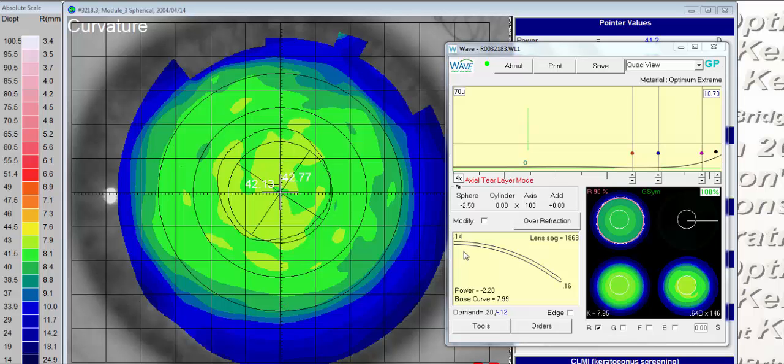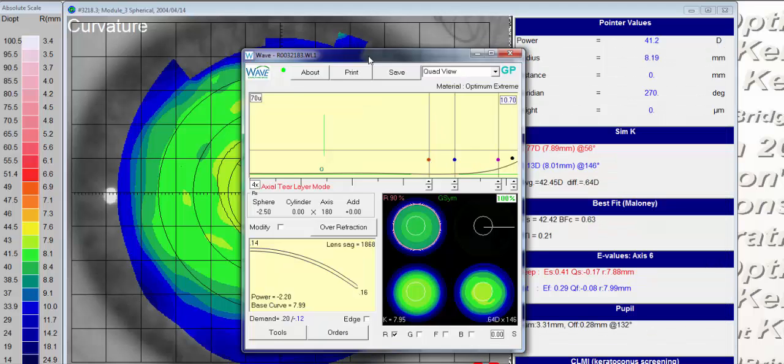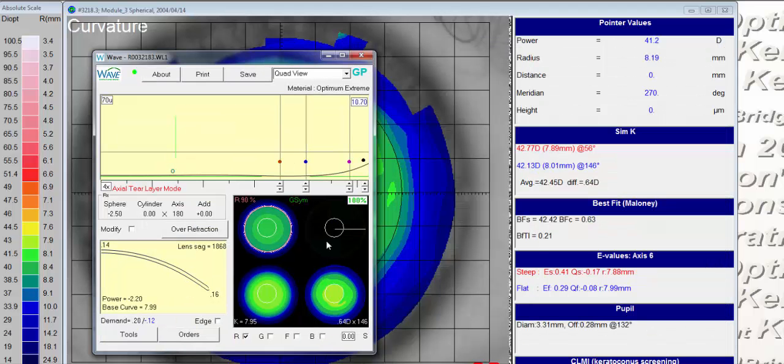Let's talk about edge awareness, edge comfort with waved lens designs. And I want to put some perspective on this. This is just the default lens. It's not the lens, but it's a place to start. And we've become accustomed to expecting to see this kind of look with our lens designs. But let's look at other sources.